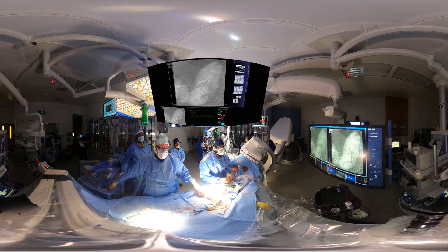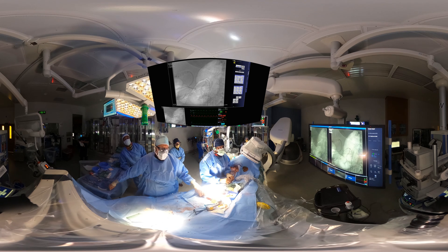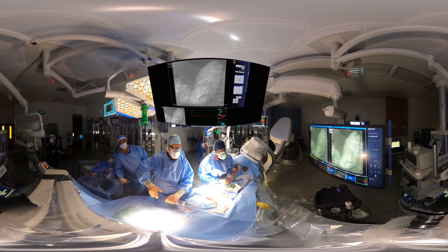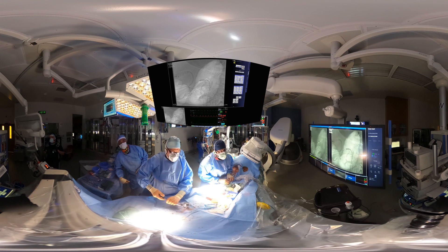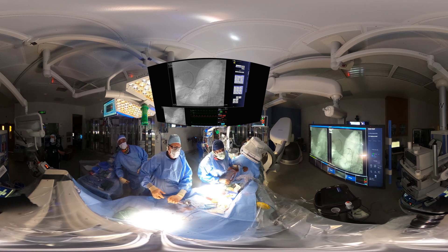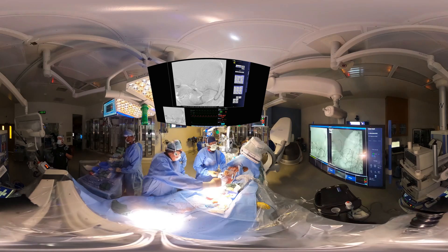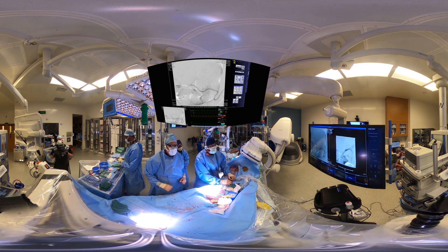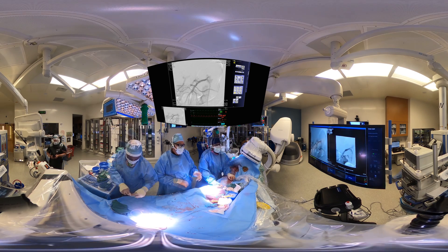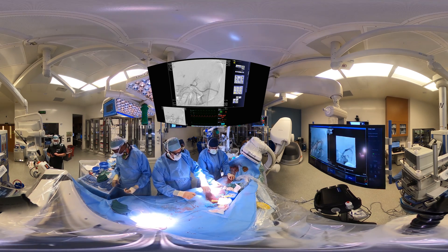One of the nice things about this technology is we can virtually add in virtual screens to give you a better view of what's going on. Here you can see the tour guide. What we're doing is now putting in — I believe it was an 8mm VBX. The glide wire was exchanged for a Rosen wire, which is down the branches of the superior mesenteric artery. Now we've shot the angiogram, and those screams of joy are because the middle colic is now filling. We lost that major branch with pre-dilation, but by re-establishing the true lumen with the VBX — and obviously not covering that side branch — that branch is now filling. We're very happy to have gotten out of this potential complication.